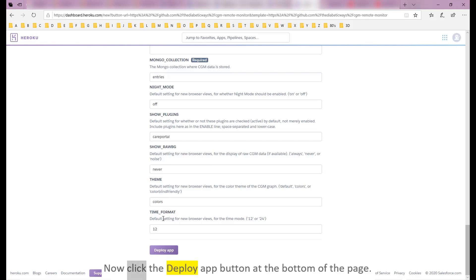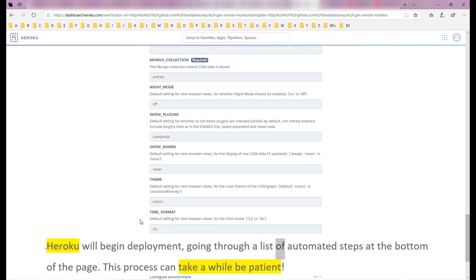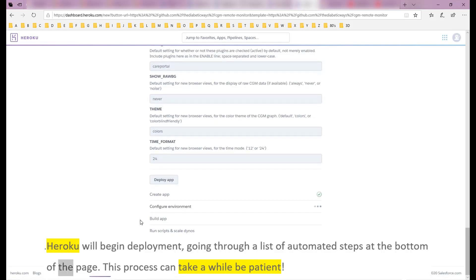Now click the Deploy App button at the bottom of the page. Heroku will begin deployment, going through a list of automated steps at the bottom of the page. This process can take a while, be patient.